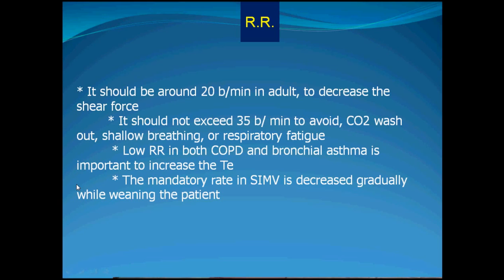When you come to the second part, which is the respiratory rate, the respiratory rate plus the tidal volume determine the minute volume, which is responsible, as I mentioned before, for adjusting carbon dioxide and pH. And this is the net result of the basal metabolic rate or the metabolic state of the patient. So you should keep that in mind.